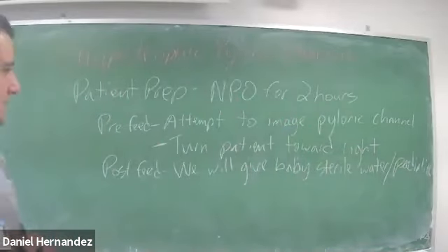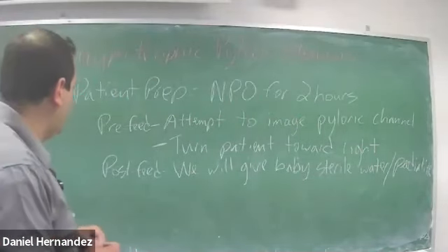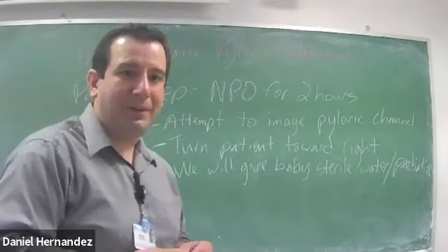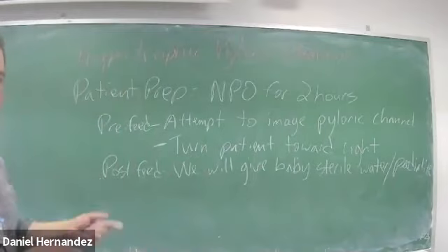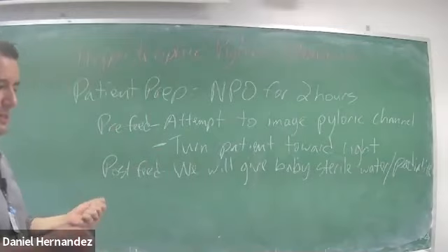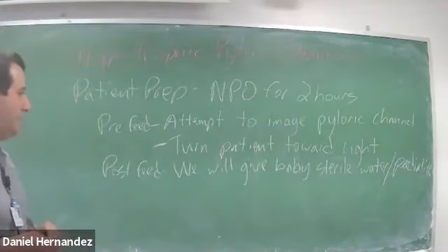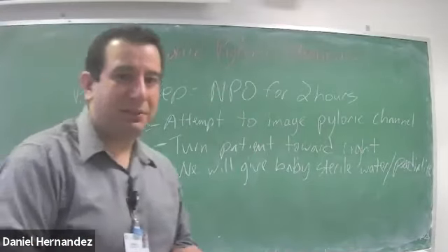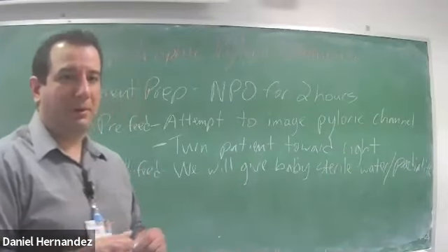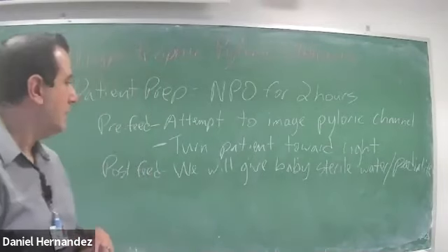But you want to fill the stomach at this point, so we'll feed the baby the sterile water. It'll take a couple minutes, but it's a good opportunity. The baby will typically calm down at that point and relax a little bit, and you let the mother hold the child, sit in a chair, and give them the little bottle of sterile water or Pedialyte so they'll feed. Instinctively, the mother is always going to ask how much they have to drink. The more they drink, the better the exam is going to be, so try to encourage them to drink as much as possible.